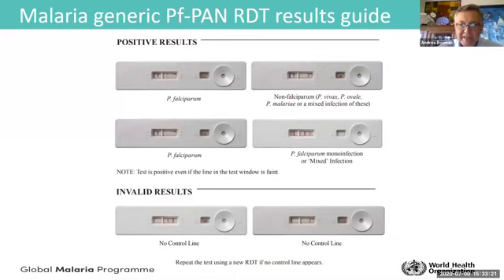Yeah, thank you, Dr. Passman. I would also add that it happened with us in Bosaso, but there was a lot of confusion. Then we sent 2 batches, 95 samples with 2 lines, to Cambridge and to Camro 3, and another batch of 45. And all of them turned out to be single falciparum positive, not mixed. Yes, yes, very good.